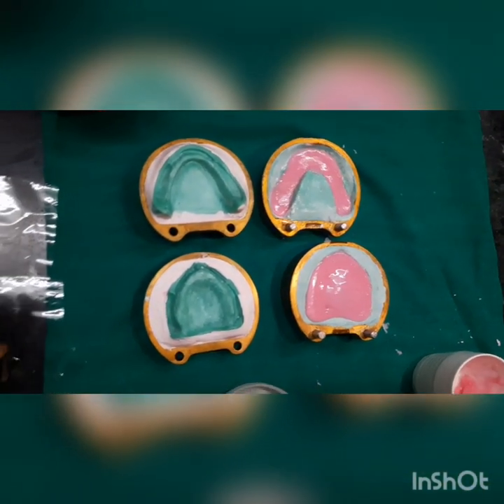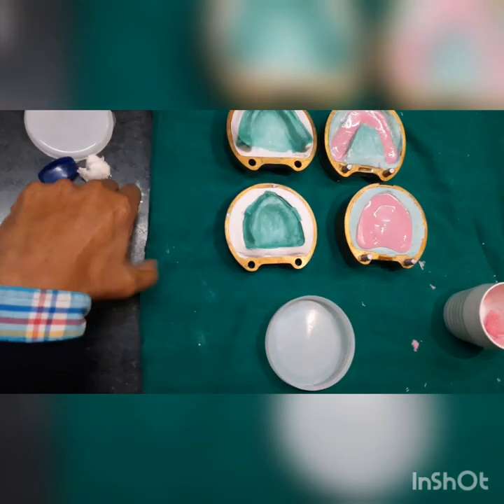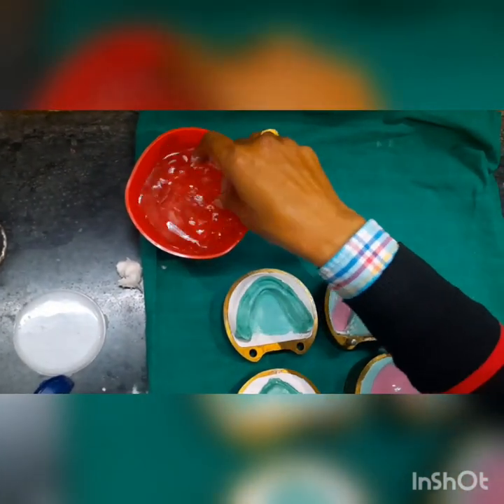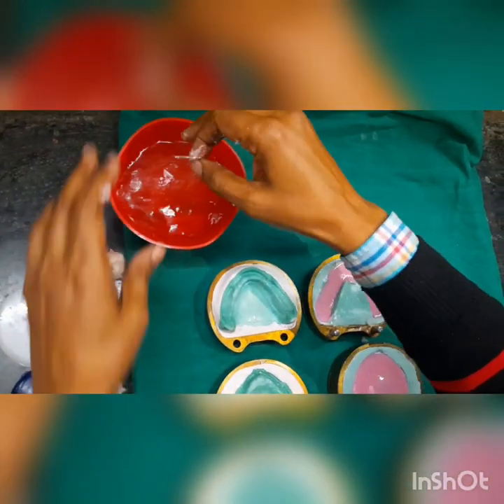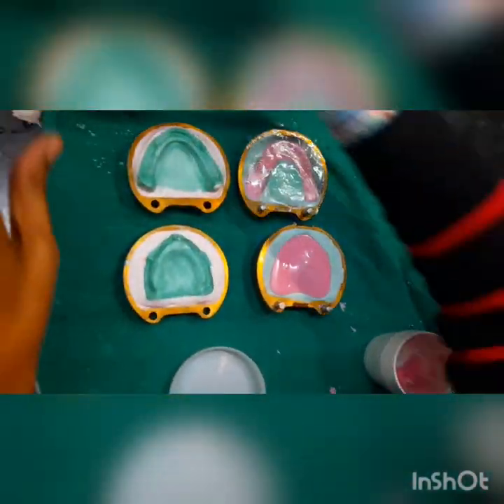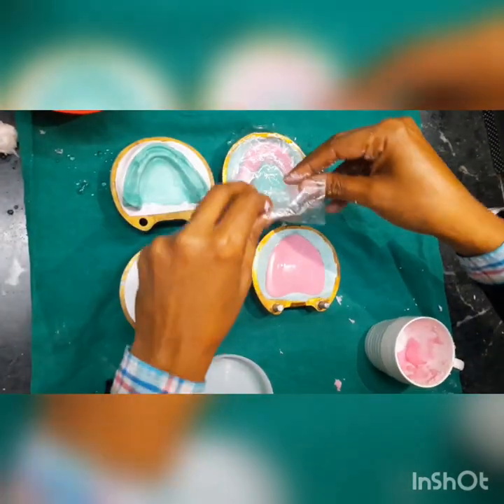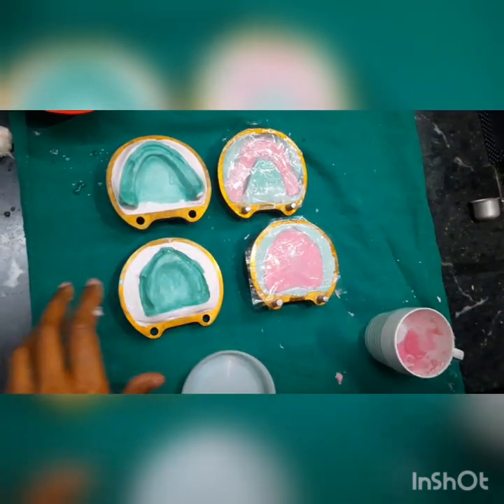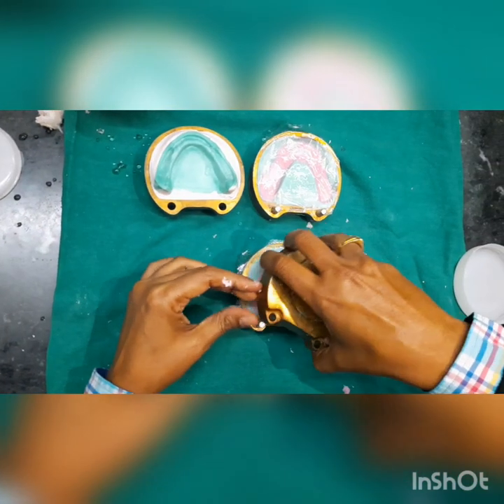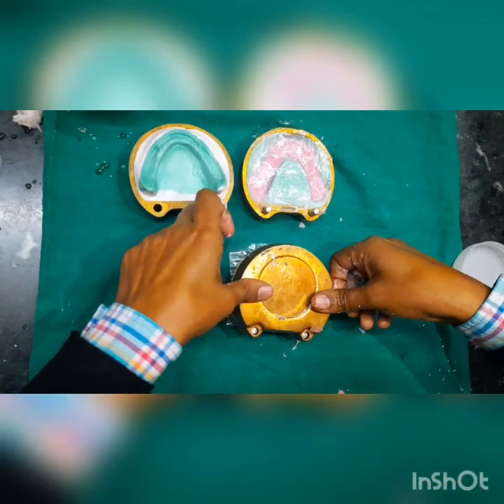We need to take plastic sheets, wet them, and apply the plastic sheet over the mold. This will be handy when we are doing our trial closure. Now we will approximate both members of the flask and seat them nicely.